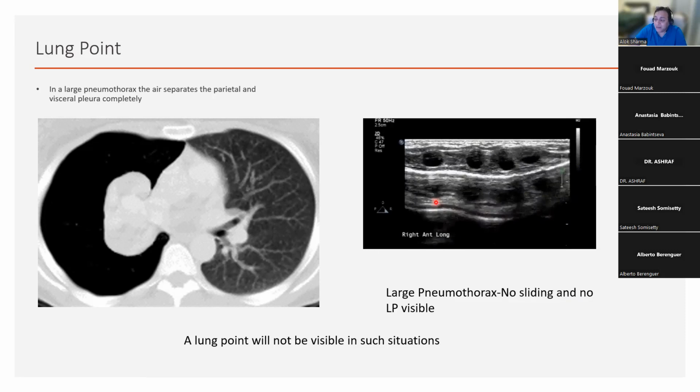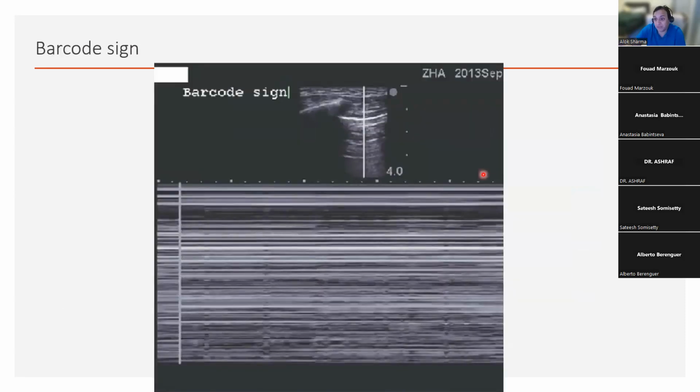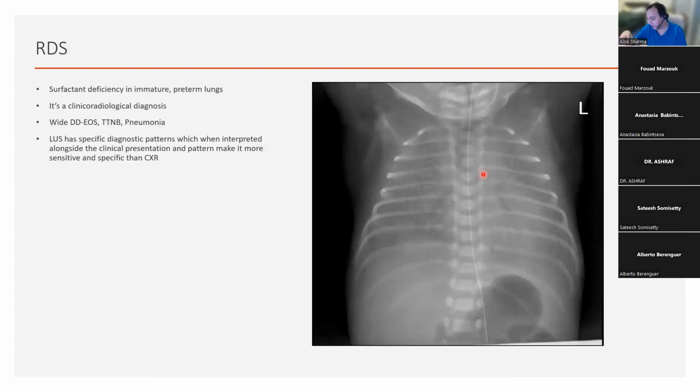Now, ventilated babies, like this is a baby who had a diaphragmatic hernia. I really want to be 100% sure that I need to put a drain in a baby with a congenital diaphragmatic hernia. So what I would say is clinically correlate. Absolutely. You have no symptoms. My recommendation to you would always be to get a chest X-ray where possible, while you're learning, until you develop the confidence.